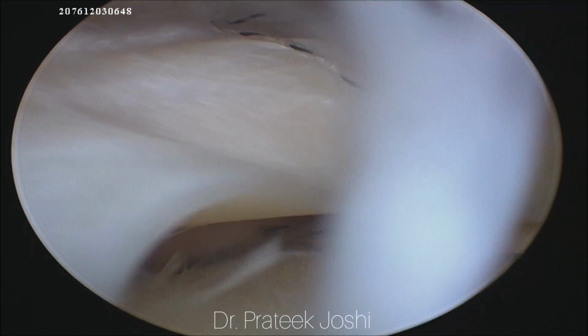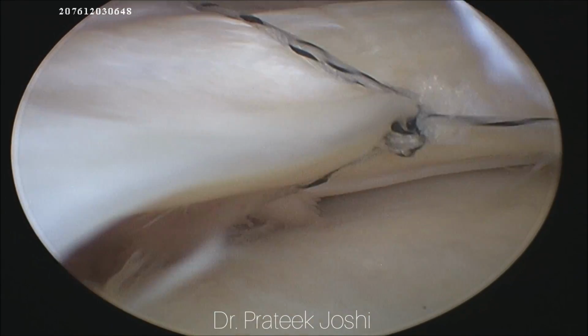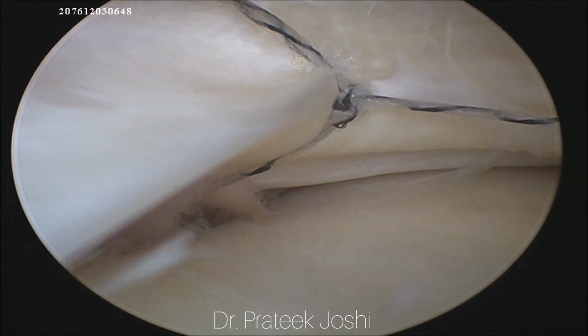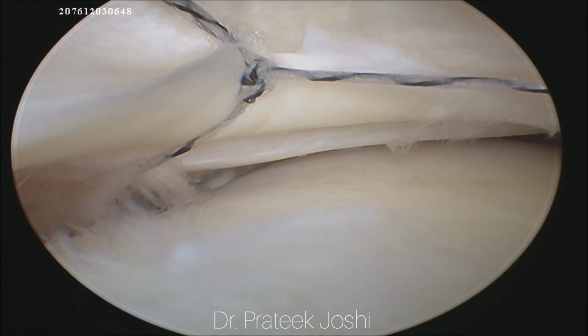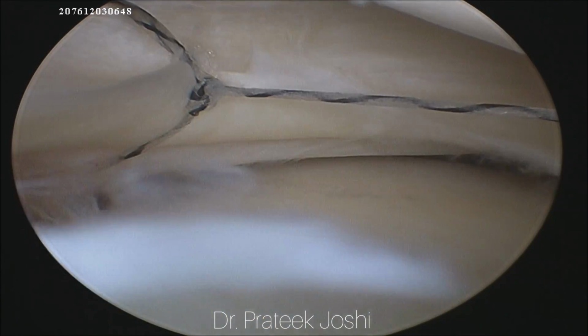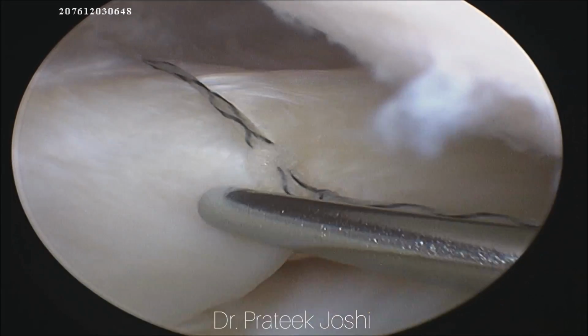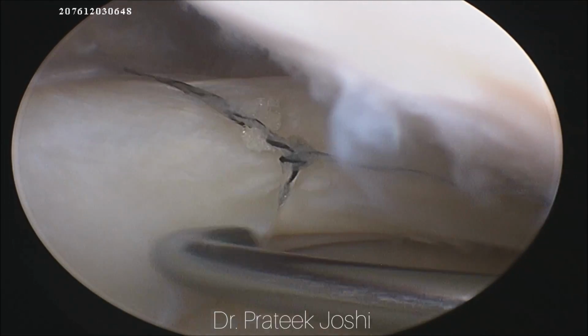As I have pierced the capsule, I have deployed the second implant, and as you can see, now I am tightening the knot, and you can clearly see that the meniscus is getting reduced. There is slight eversion of the edge of the meniscus, which I am going to correct with the help of an arthroscopic probe.